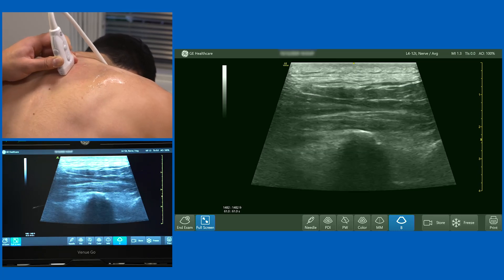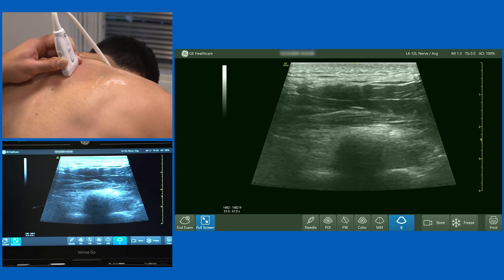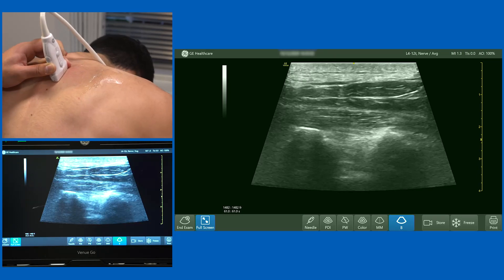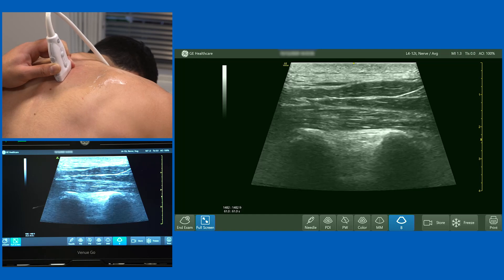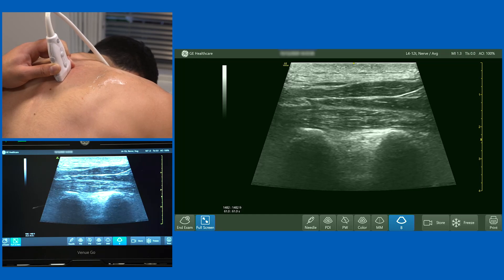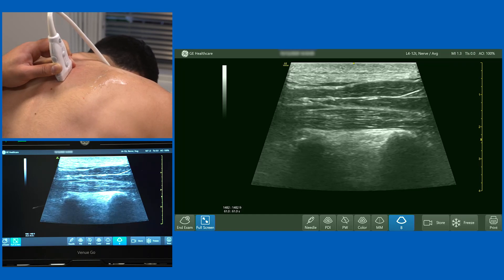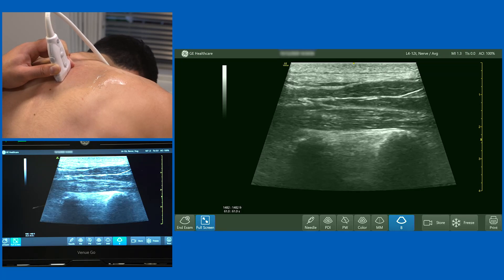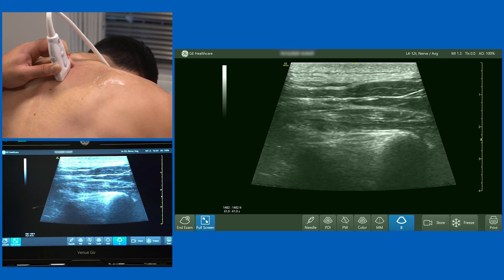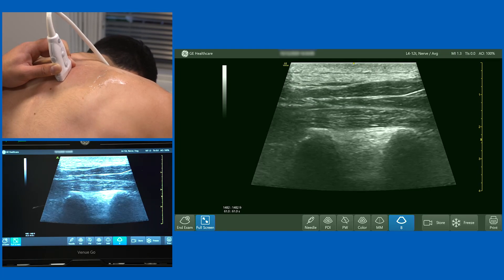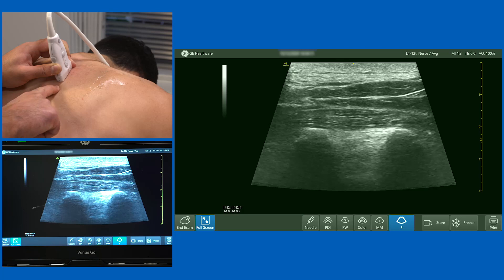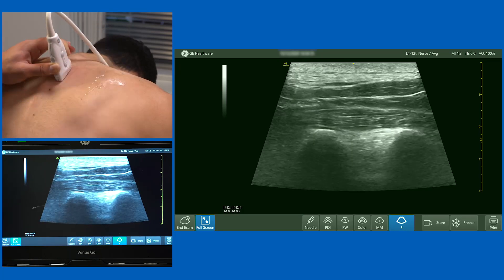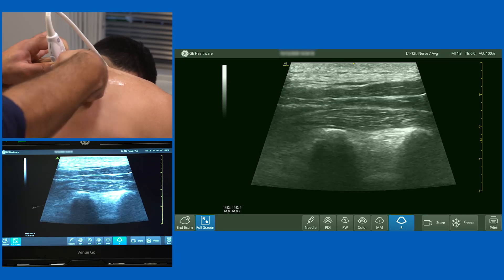We've now got a transverse process on the screen, with a muscle bulk above and below. As I slide up and down, it's important to get at least two transverse processes on the screen. Hopefully you can now see two very rectangular shaped bones with a thick muscle bulk immediately above them — that thick muscle bulk is the erector spinae group of muscles. You can approach from either the caudad or cephalad aspect, coming in from below or above the probe.